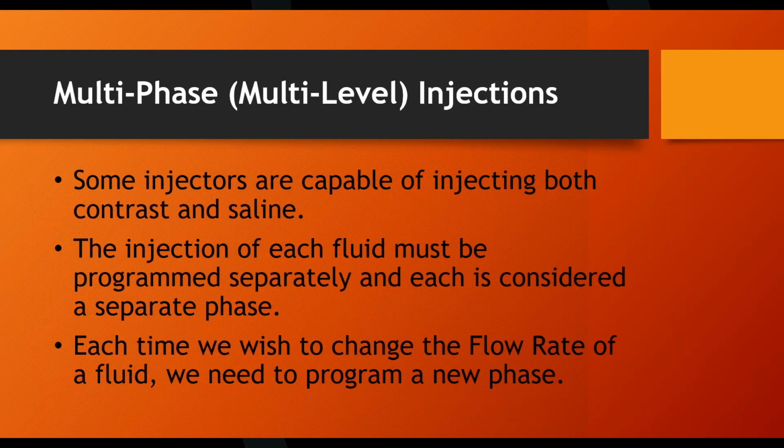Yes. While they're doing it, because a lot of teams, and I haven't gotten to it yet, but there is something called ISI, Imaging System Interface. So the actual injector will electronically interface with the imaging system so that it can be set up either way, where the X-ray exposure switch starts and stops the injector, or they can set up that the injector start switch starts and stops the X-rays. Okay, that's not always the case. They don't always use the imaging or the interface capabilities, but they often do. It's not uncommon at all.